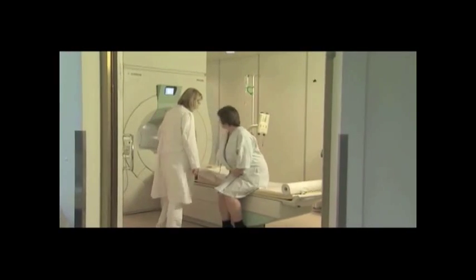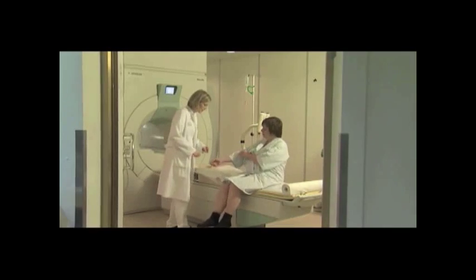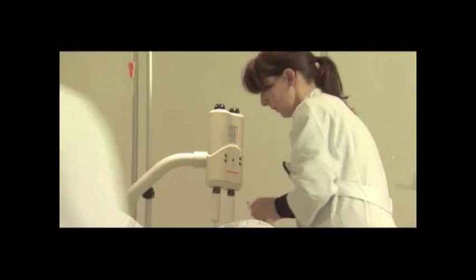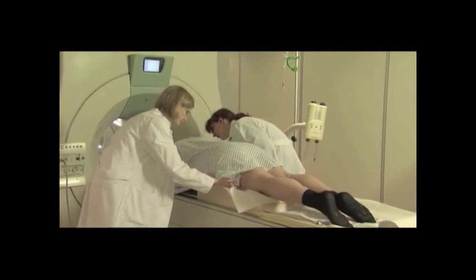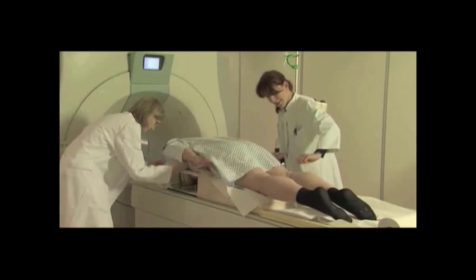Once the patient arrives in the MRI suite, an IV is started to facilitate the injection of the contrast agent to aid in visualization of suspect tissue. The patient should be reminded of the importance of remaining still during the procedure.